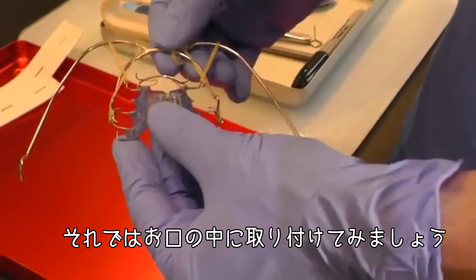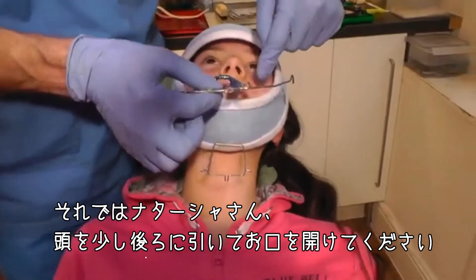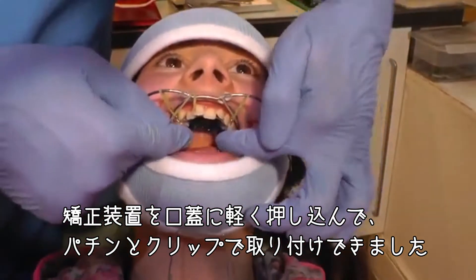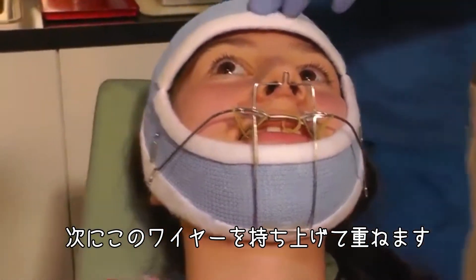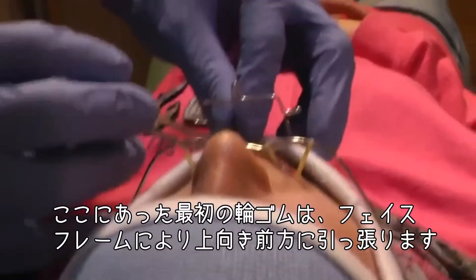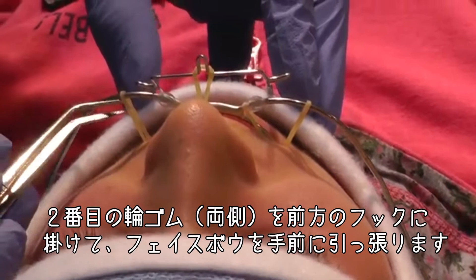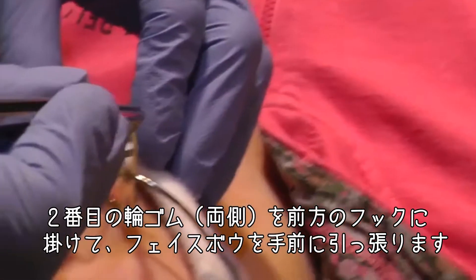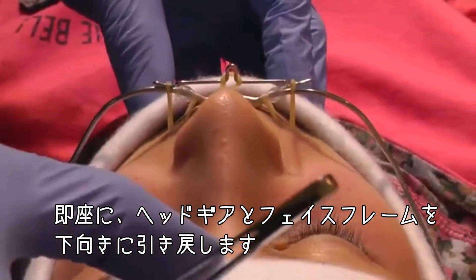Now we can see that in the mouth — Natasha, head back a little, open nice and wide. I place the appliance and clip it up into the roof of her mouth. I pull that one in over there, then place this one here. The first elastic I place is the one lifting up and forwards on the face frame, then one from the hook forwards on each side. Now it instantly starts pulling the headgear and face frame down.